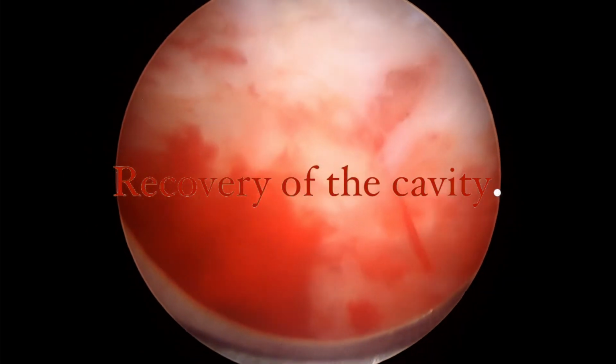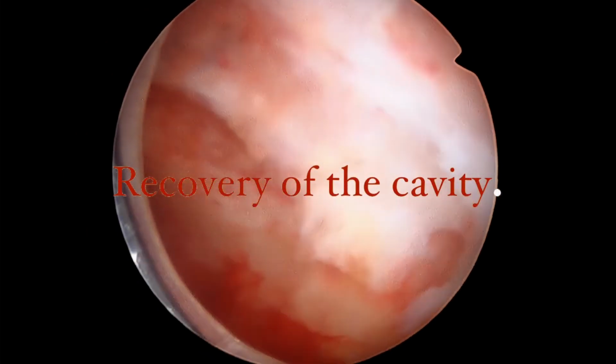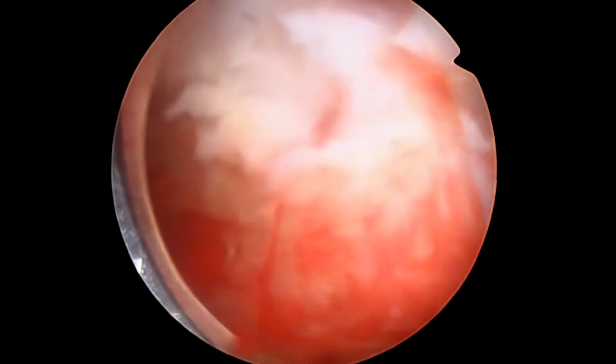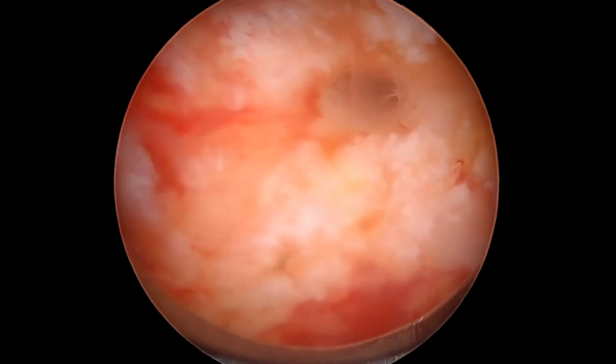We put a Foley balloon for about 10 days in this patient, and we manage them with cyclic progesterone and estrogen. Of course, we need to have a second look hysteroscopy after about 2 months.